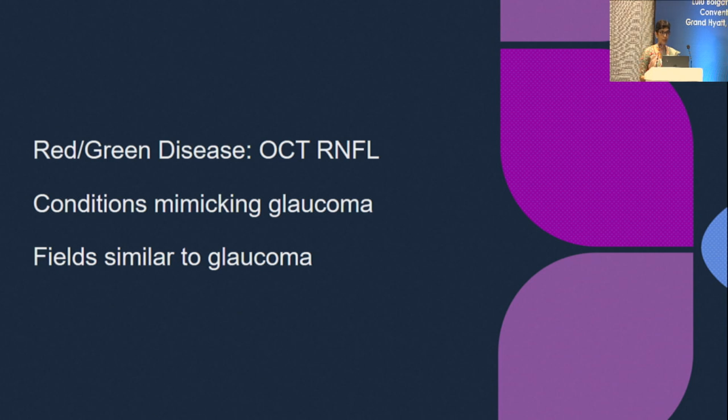When we take the patient for glaucoma evaluation in the glaucoma clinic, we usually perform an indirect slit lamp biomicroscopic examination with a 90D lens or a 78D lens. That is our prime method of examination. We also do a visual field and some ancillary tests to correlate that.